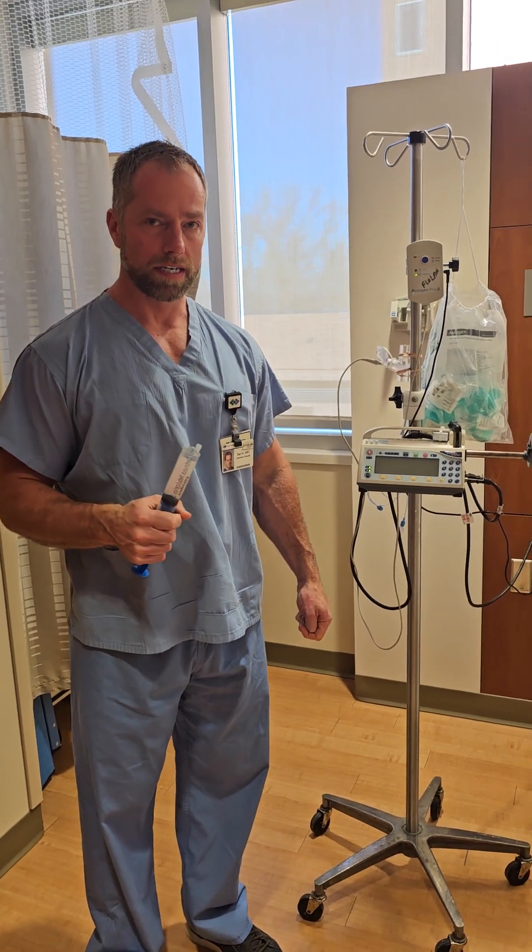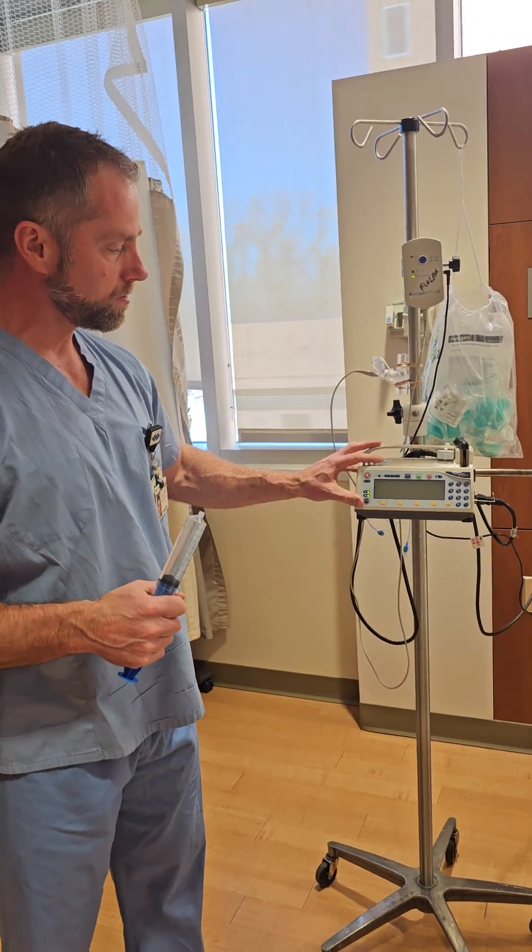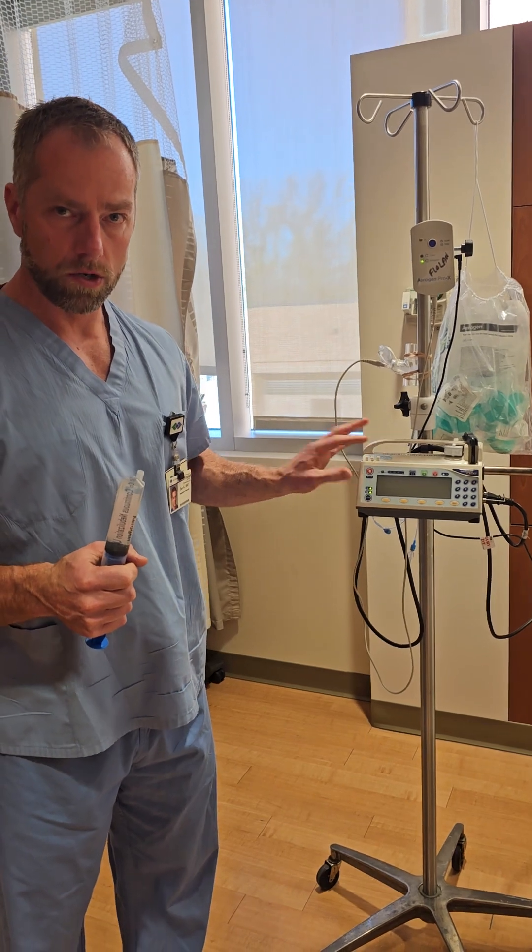Greetings! I'm going to do a demonstration using the syringe pump to deliver Flolan to a ventilated patient.